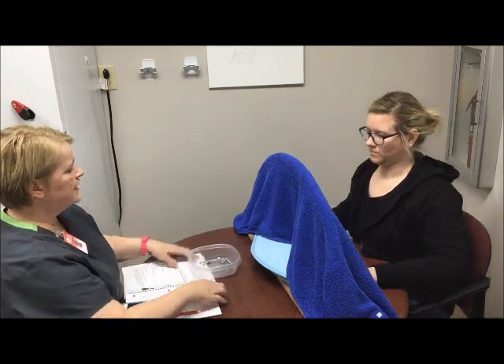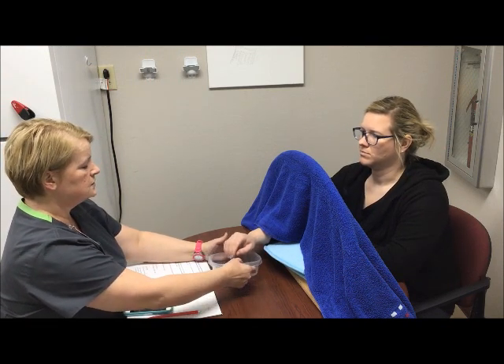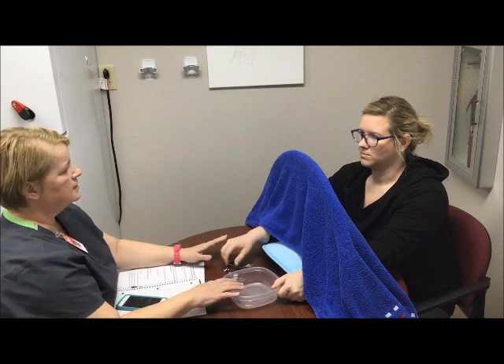Okay, now the second part of our test is that you get to do this again, but you won't be able to see. What I need for you to do now is put your right hand through underneath the towel — here's the container. We're going to start with your right hand first so you can feel where everything is, and I'll keep it close by. We're going to do the same exact test again, but this time you're not going to be able to see. Now with your left hand, will you bring it through and hold on to the container so you know where it is at all times. Again, you're picking up one thing at a time and putting it in the container, and we're going to time this as well.